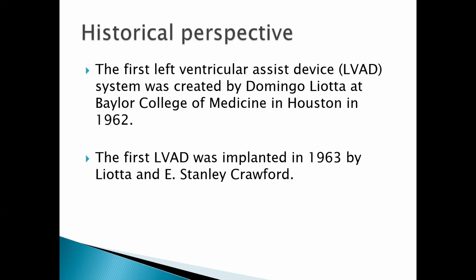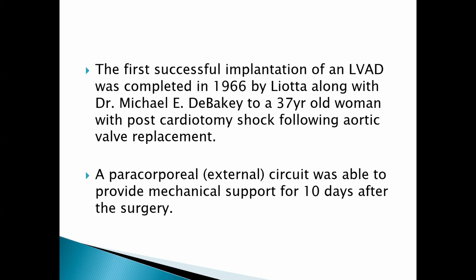Next slide, please. Then in 1966, the very first successful implantation was noted. It was done by Liotta and also Dr. DeBakey, in a 37-year-old woman. The woman was said to have had post-cardiotomy shock following an aortic valve replacement. They placed a paracorporeal circuit, which helped the pumping system work for 10 days after the surgery.